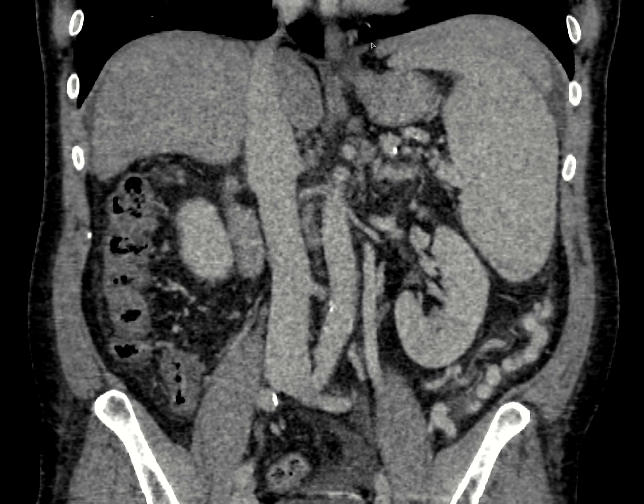And so the way we're supposed to measure the spleen size is in a craniocaudal dimension. So it's somewhat like this, and so the top to the bottom of the spleen here is measuring 16 centimeters, and so that is splenomegaly. Anything kind of greater than 13 centimeters is considered splenomegaly.